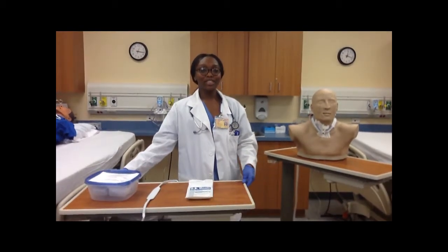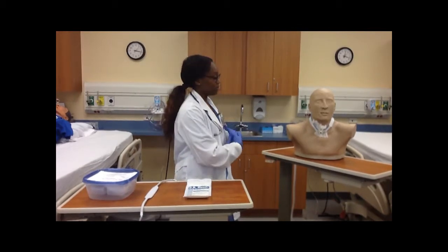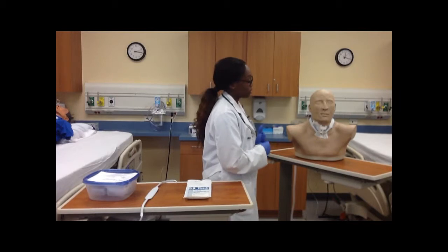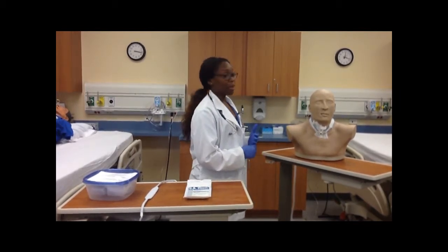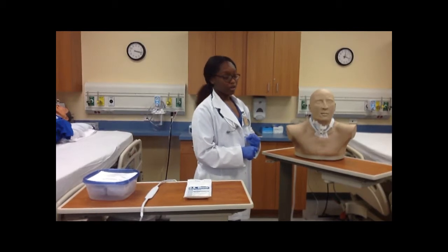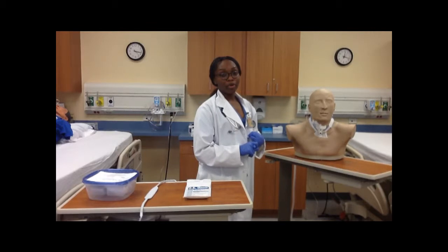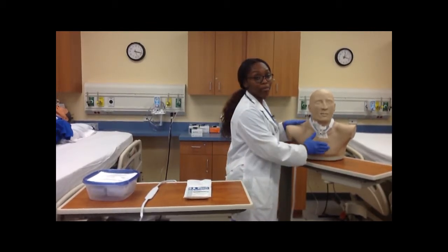Now, the first thing you like to do is introduce yourself to the patient. Hello, my name is Doris St. Louis, and the reason I'm here today is to do a trach cleaning. Once you've done that, you check your patient for their medical identifier. You need to check their medical record number and their date of birth. Also, assess your patient's vitals and their breath sounds.